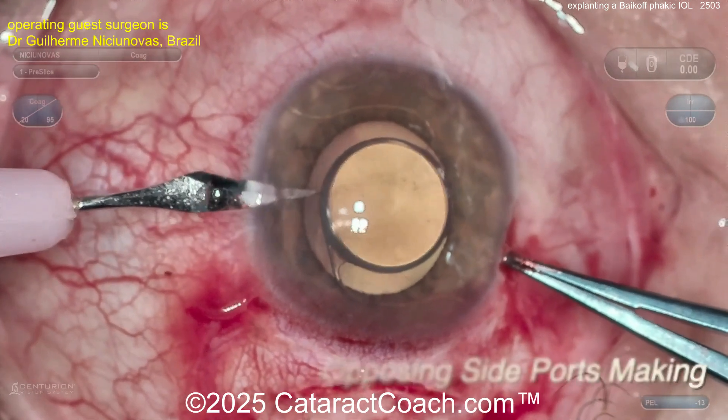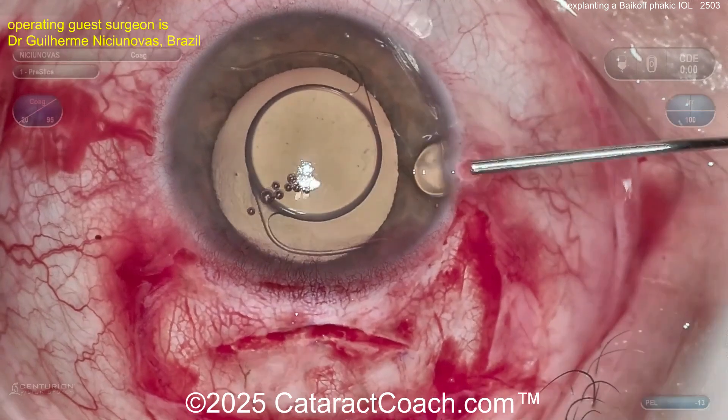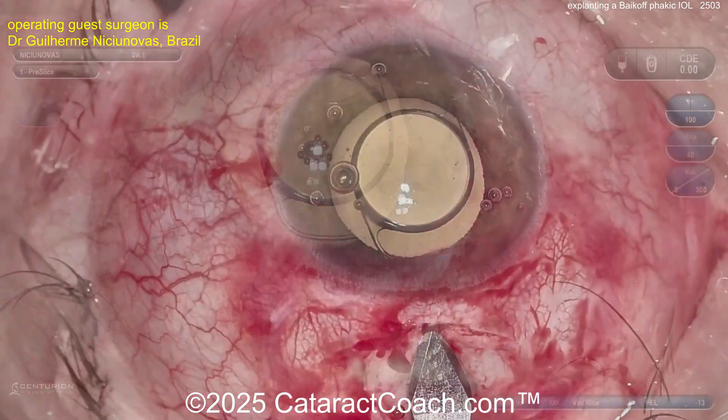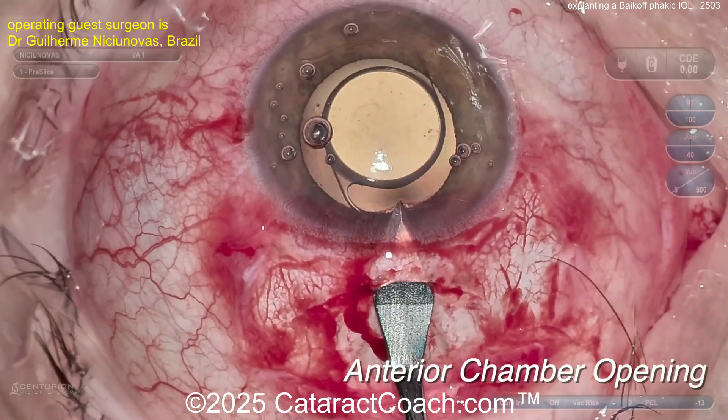We typically do a bimanual IA to remove cortex in these types of cases. Now put some anesthetic agent in. Get that pupil dilated. Look at that phakic lens — that's so interesting. Finally, entering the anterior chamber at this point.